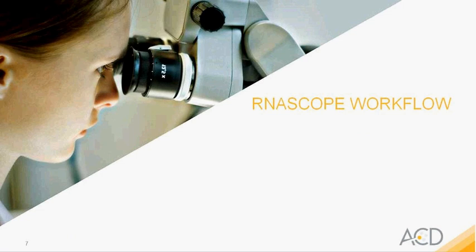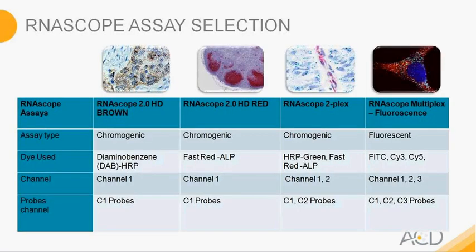The next is RNAscope workflow. Before I discuss RNAscope workflow, I would like to introduce you to the products that we have. The first product is RNAscope 2.0 HD Brown. This is a chromogenic product that utilizes DAB and HRP chemistries. You can use this with probes in channel 1, and they're annotated as C1 probes.